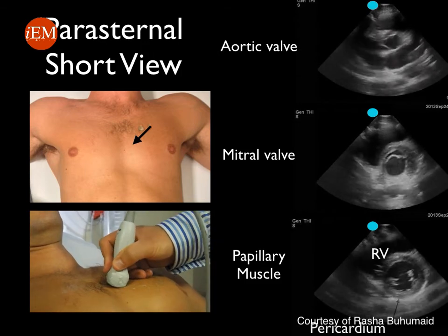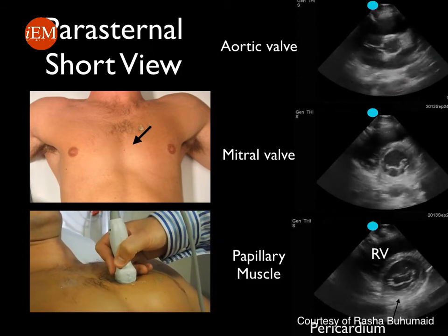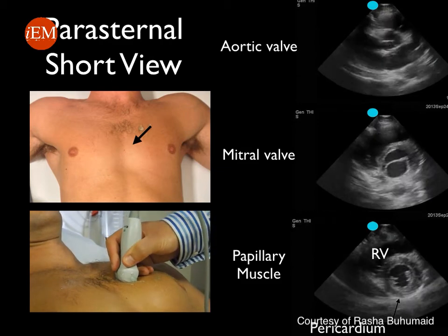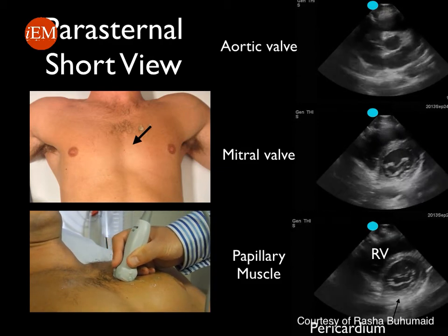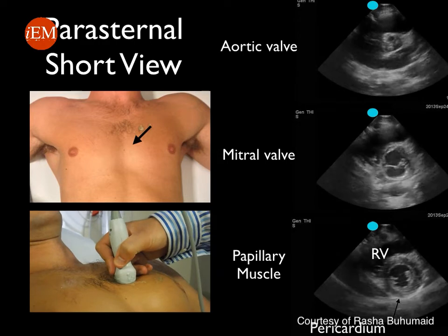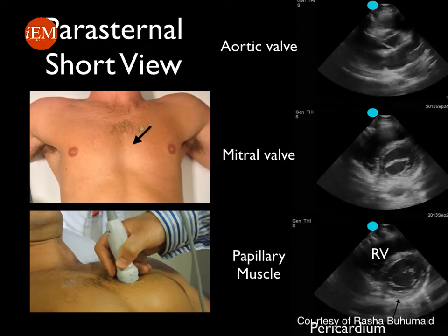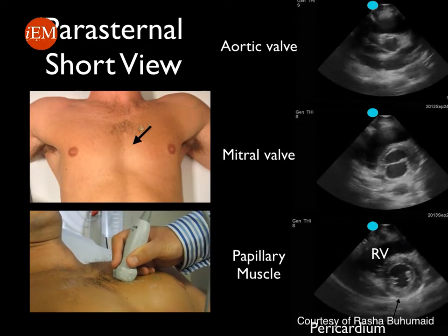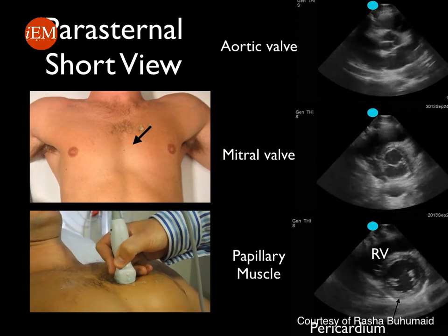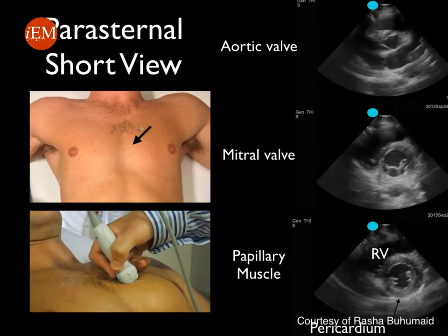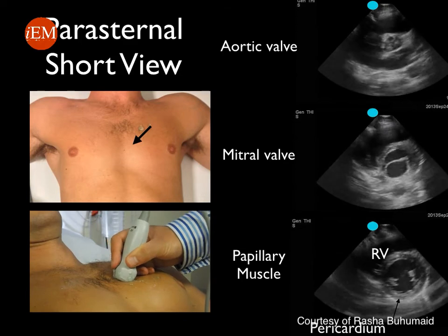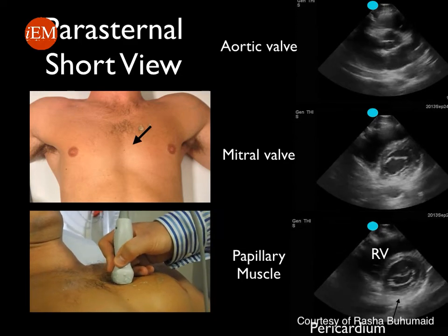Note that the white stripe surrounding the heart is the pericardium. The crescent-shaped chamber is the right ventricle, while the circular shape is the left ventricle. The three images correspond to the different levels of a parasternal short view depending on the angle of your probe.